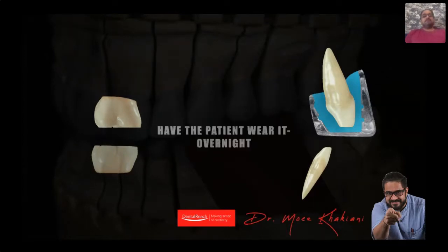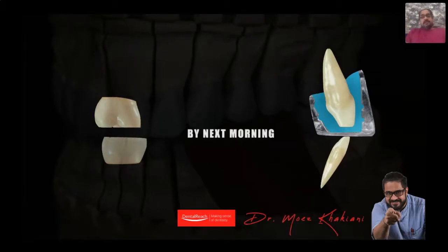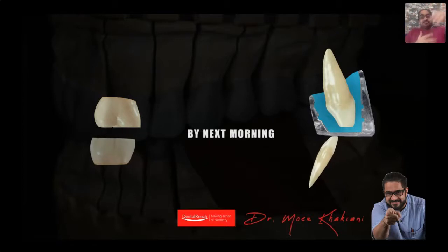As the patient bites down into this, remember, back teeth don't touch, only front teeth touch. Because back teeth don't touch, the inferior lateral pterygoid muscle relaxes. So what happens over a period of time? The entire mandible begins to swing backwards. Remember, the condyle goes upwards. As the condyle goes upwards, the lower incisor comes back.